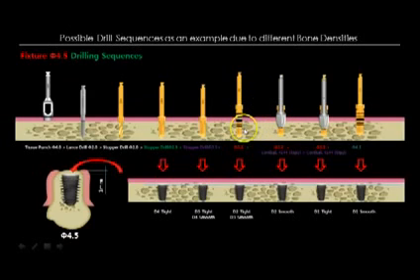So with your 3.8 drill, you can place the implant very nicely because it's almost, again, to the width. But if you're in a thinner ridge area and you don't want to drill out to 3.8, again, that's your call. It's all relative to what you run into with the patient's thickness of the ridge. So that's why my preference a lot of times is 3.3 or your 3.8 with your cortical bone drill.